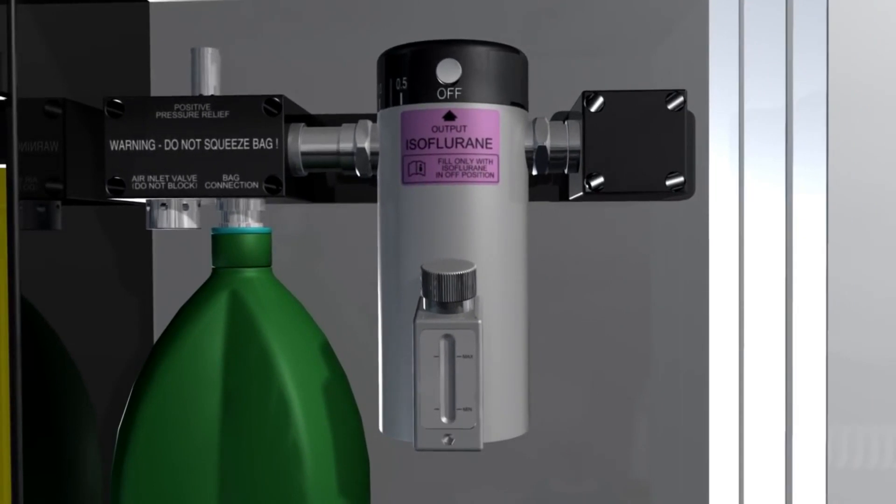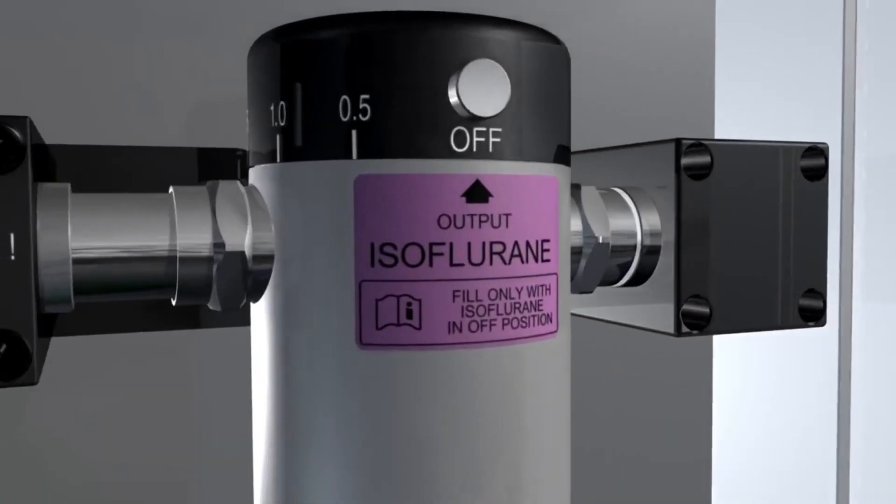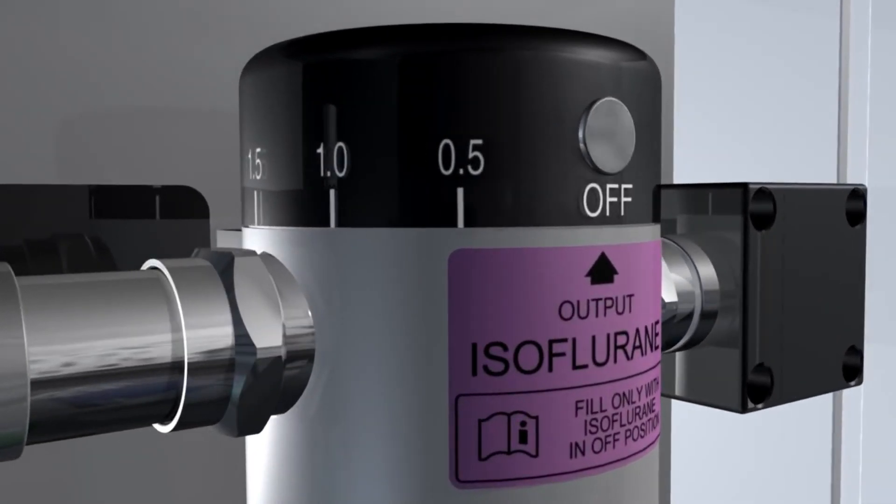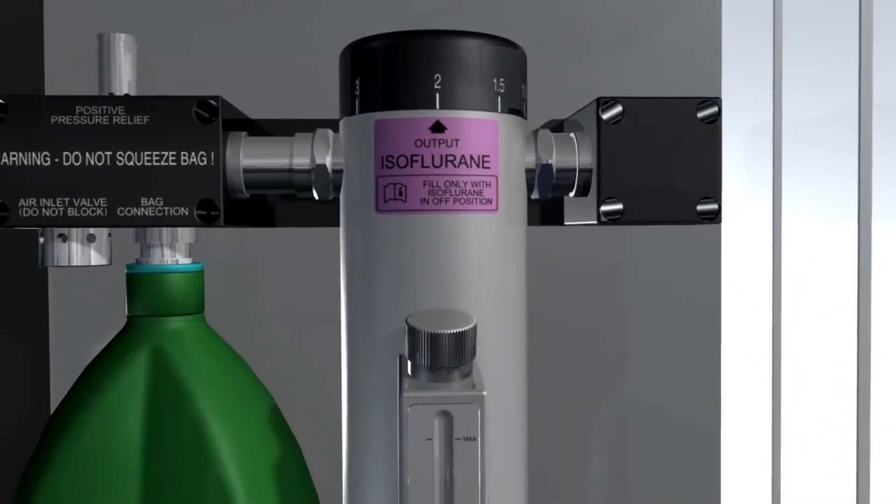The plenum vaporizer is driven by positive pressure from the anesthetic machine and is usually mounted on the machine. The performance of the vaporizer does not change regardless of whether the patient is breathing spontaneously or is mechanically ventilated.